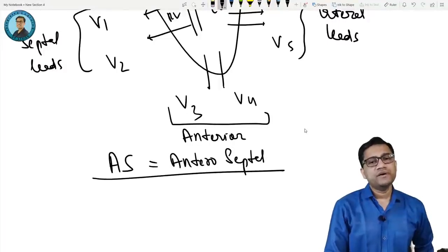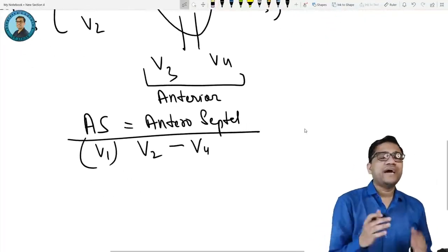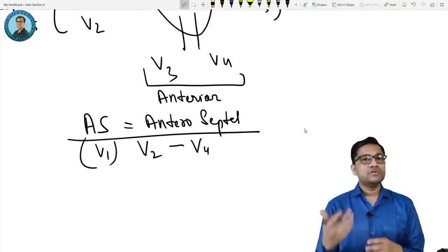Anteroseptal. So what is the term? We can take V2 to V4. Some books say add V1 also, I put it in brackets. So this is called anteroseptal. Are you clear? Anteroseptal. Okay, clear.